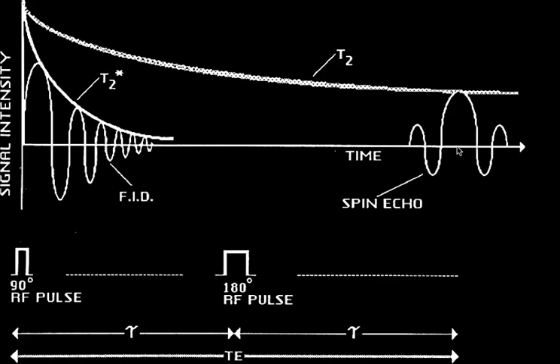Well, isn't at time 2 tau the bulk magnetization in the XY plane essentially back to zero? Or very close to it? No, the bulk magnetization vector, if it's zero, you get no signal. It's zero all through in between here.